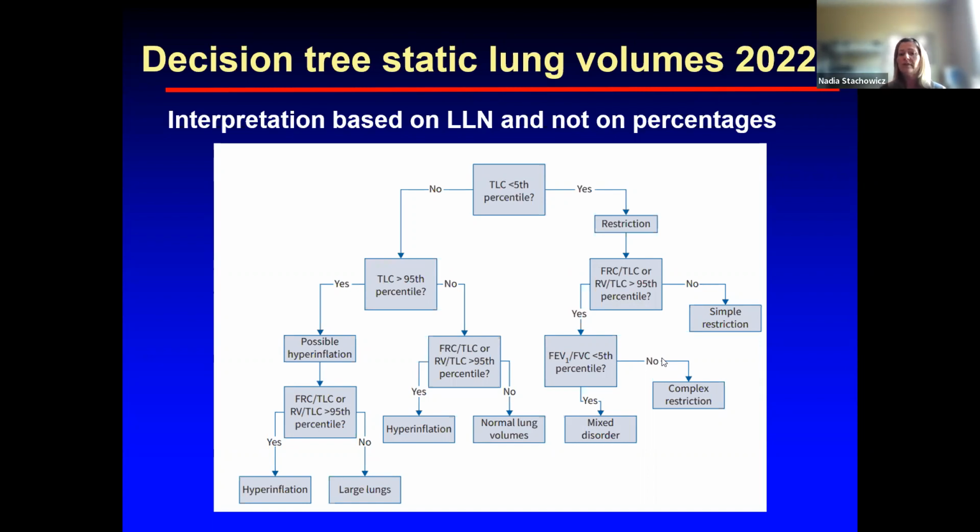Can we use a previous hemoglobin for the corrected value? And if so, how old can those results be? In my lab, we always went back about 2 to 3 weeks. We didn't go any more than that. I don't know if you have a cutoff, if it has to be the same day. How do you deal with that, Frans?